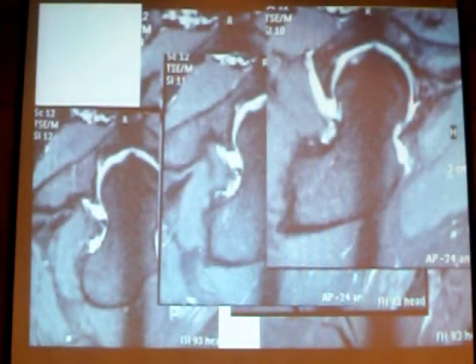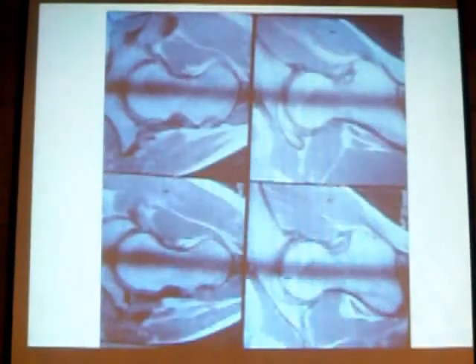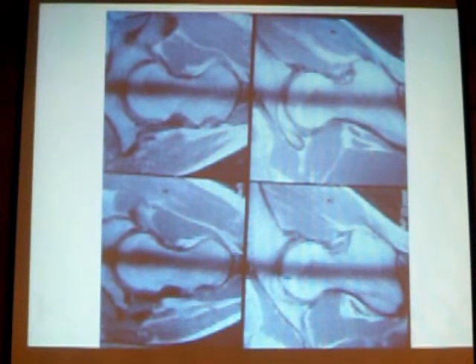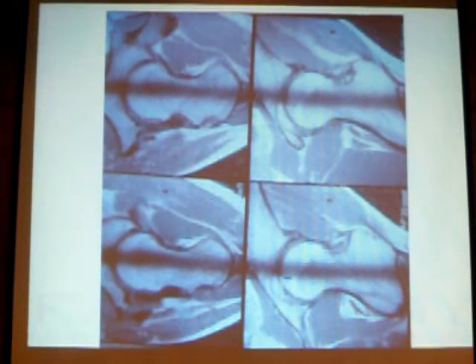This is the site of the bump. Using the radial oblique sequence, we will be able to get 360 degrees of the hip joint, and we will know how the bump is distributed — whether it is anterior or involves surgical hip dislocation.